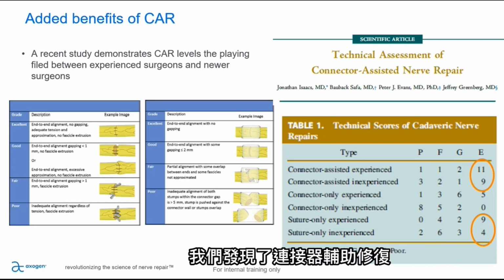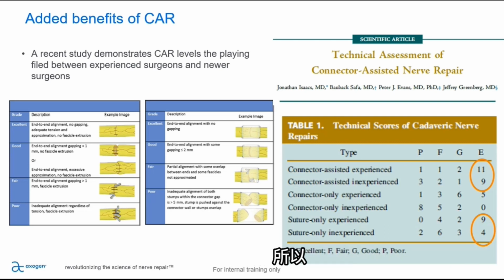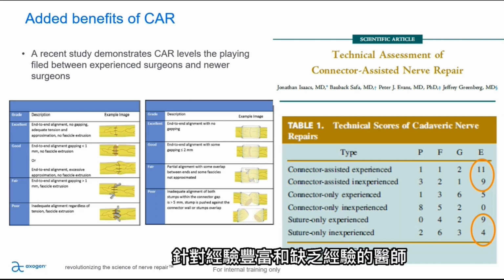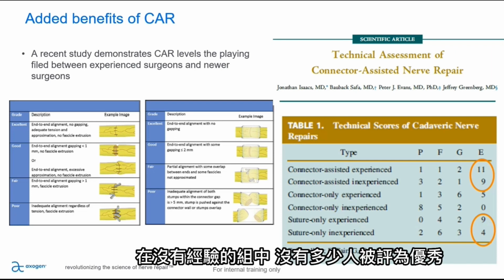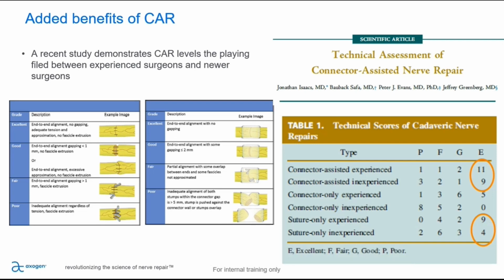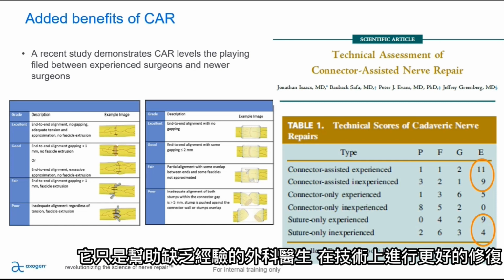And what we found is that connector-assisted repair basically levels the playing field between the experienced surgeons and the inexperienced surgeons. When you look at how many surgeons were graded as excellent in the suture repair for experienced and inexperienced, there weren't very many in the inexperienced group who were graded as excellent. But when you look at the connector-assisted repair, that number increases and is much closer to the experienced surgeons than for the suture-only repair. So it just helps inexperienced surgeons do a technically better repair.